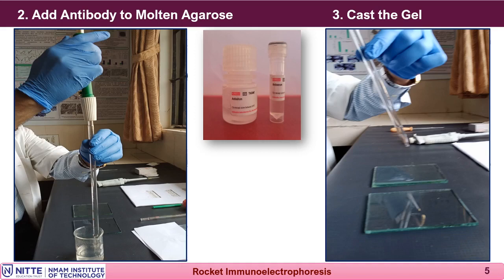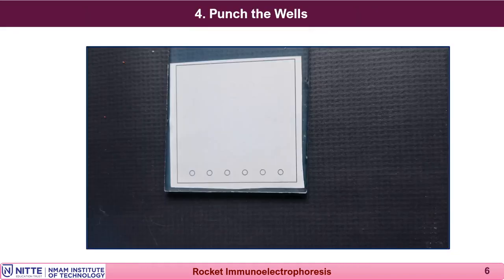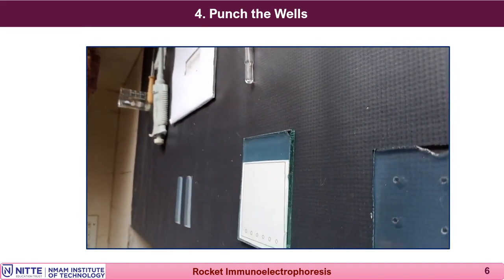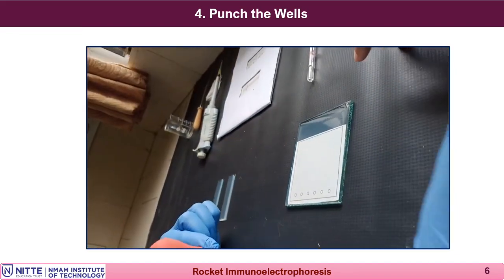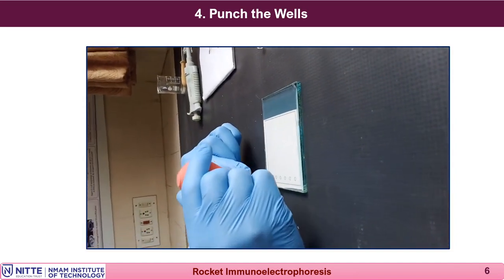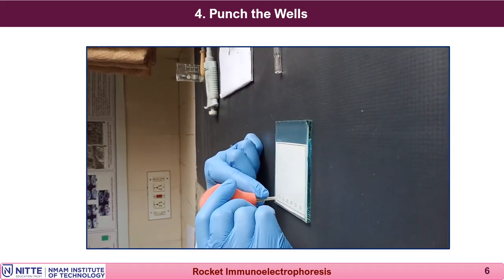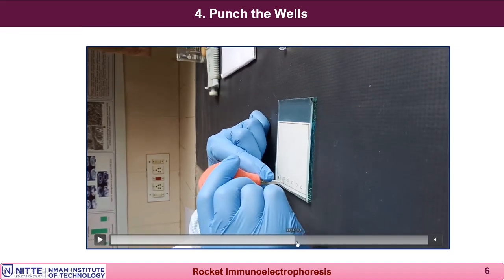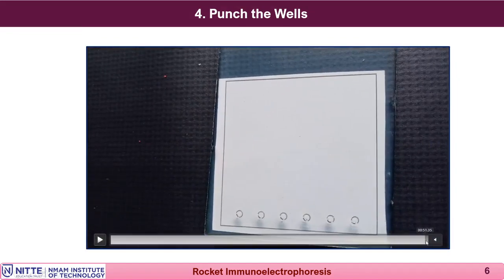After solidifying at room temperature, transfer the slide to a moist chamber and keep it in the fridge for half an hour. Once the agarose has solidified properly and been sufficiently cooled, it is ready for punching. Keep the slide on the stencil and punch the wells as shown in the diagram, with wells for the antigen on one side of the slide.